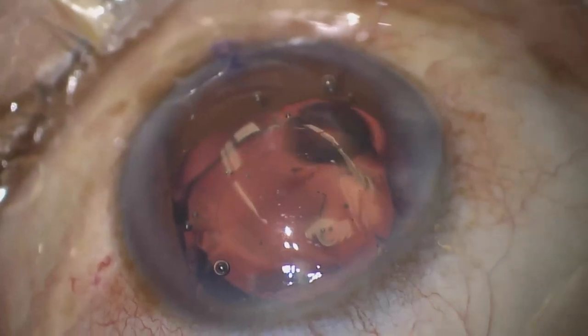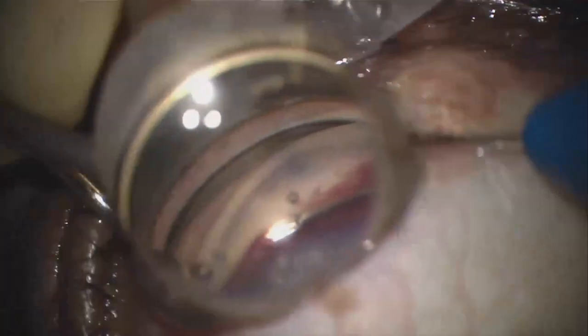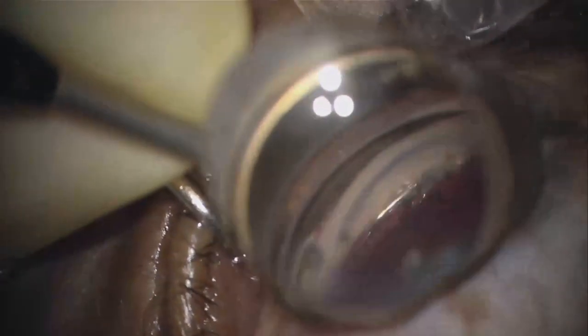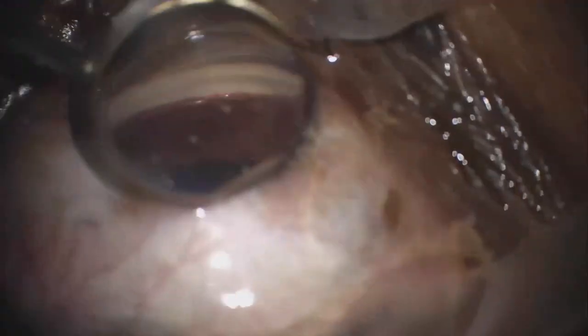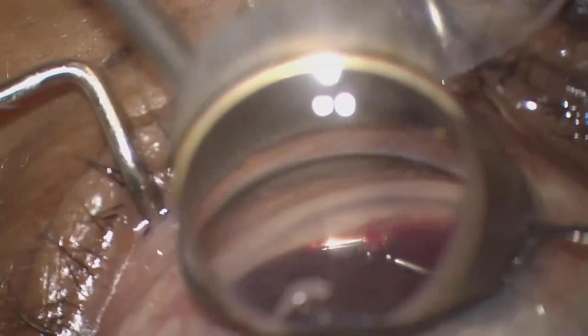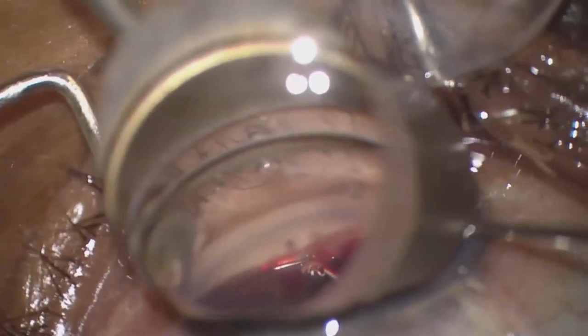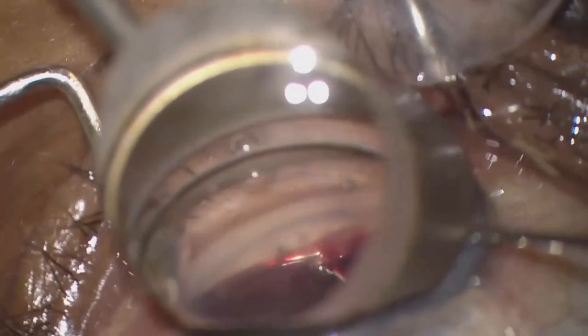Another attempt was made to insert the Hydrus at a different entry point with successful insertion. Upon examination of the stent, the position in the canal was good. A Szynski hook was used to further advance the stent into position without resistance, which is another confirmatory sign that the stent is in the proper position.